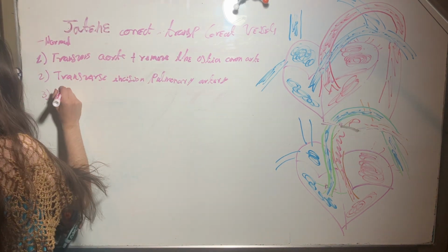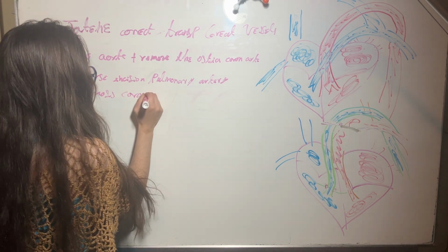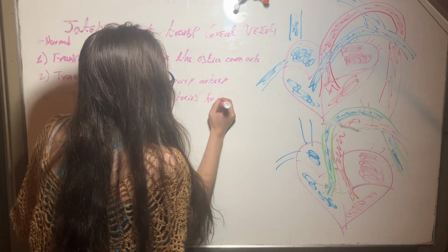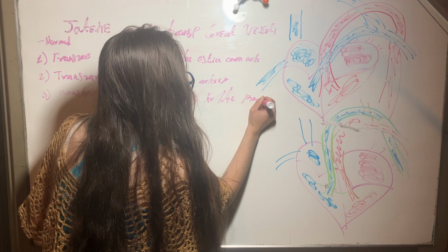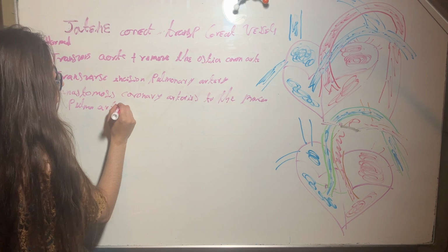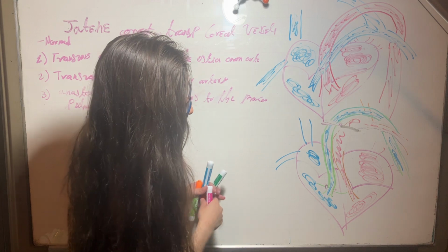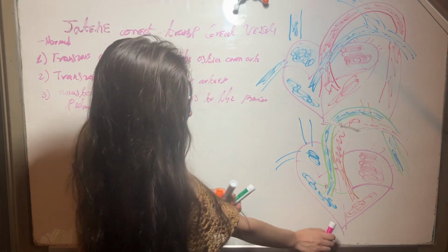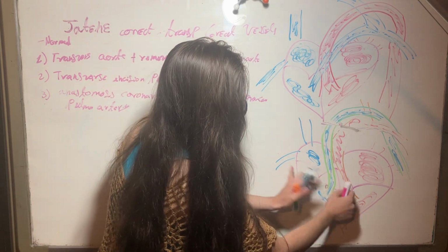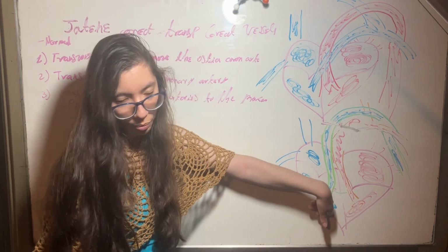So we do an anastomosis of the coronary arteries to the proximal pulmonary artery. And also we are going to repair the site where we cut the coronary arteries. It's not exactly at this moment, but this site is going to be repaired. We cannot have a hole here.